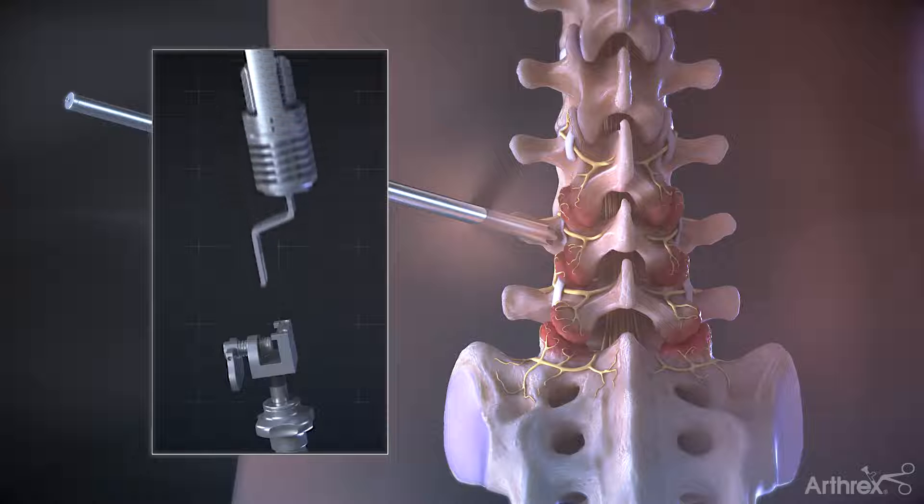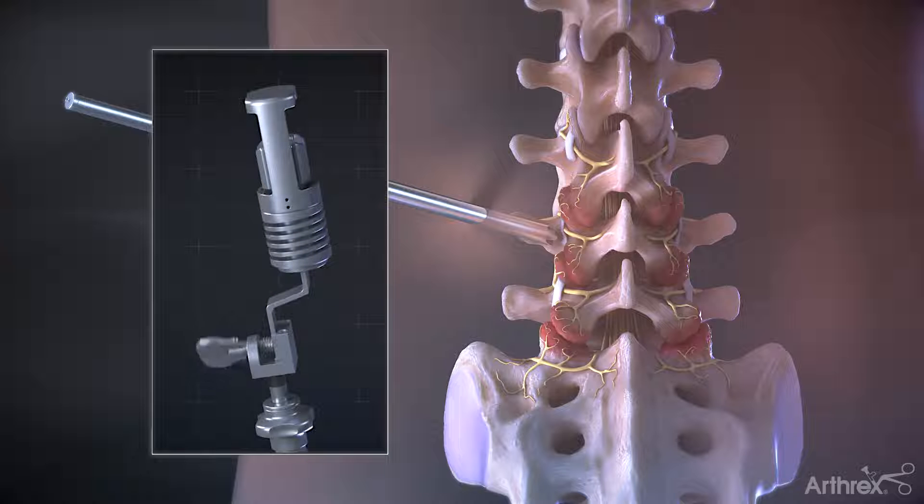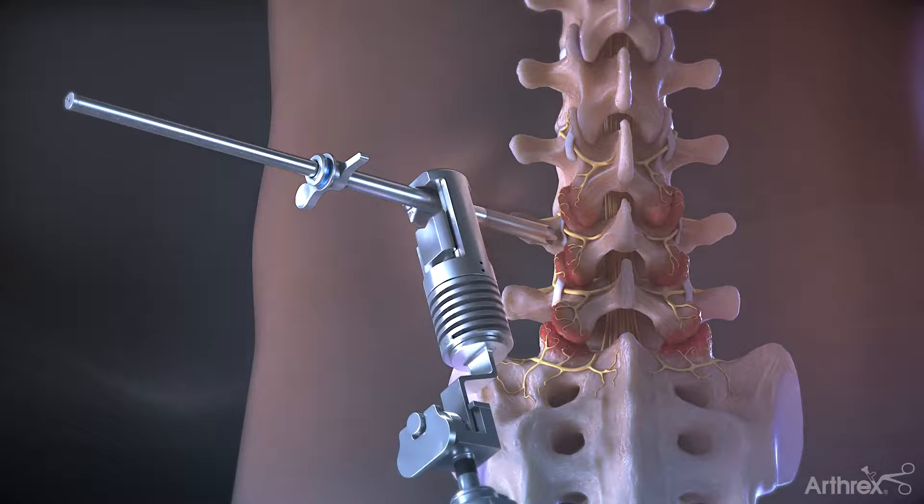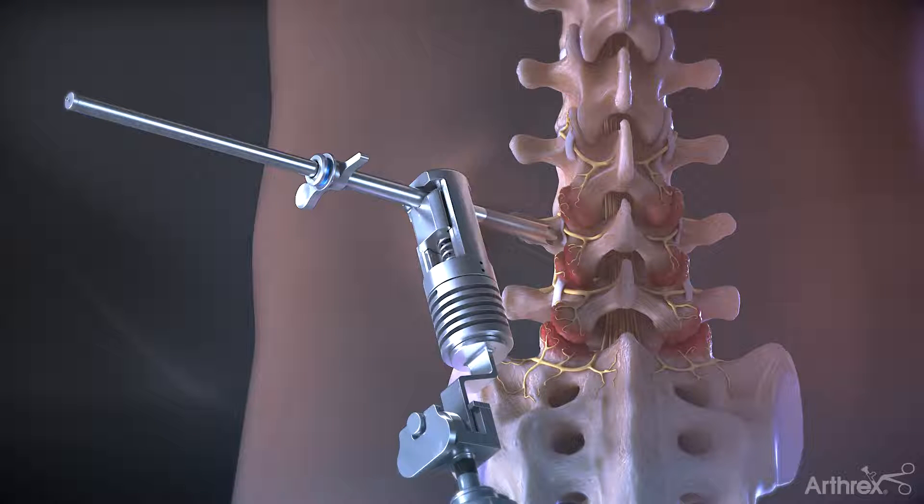Attach the cannula holder securely to the Tramano Arm Adapter. Connect the holder to the cannula to aid in maintaining the trajectory prior to removing the switching stick.